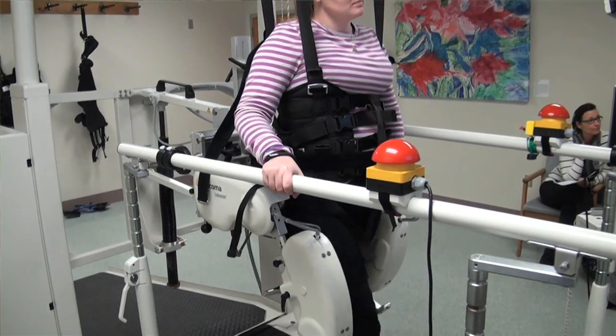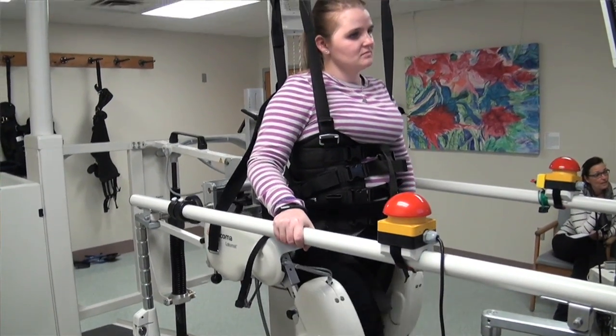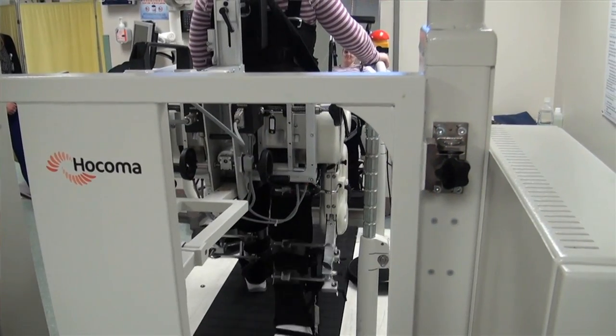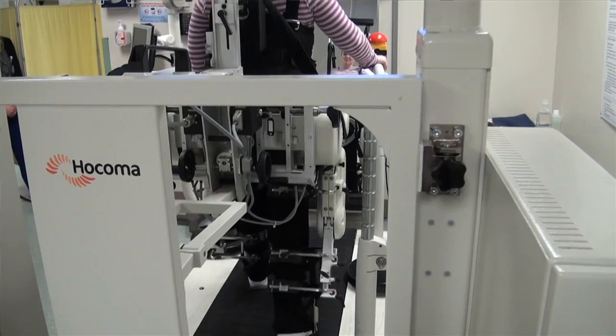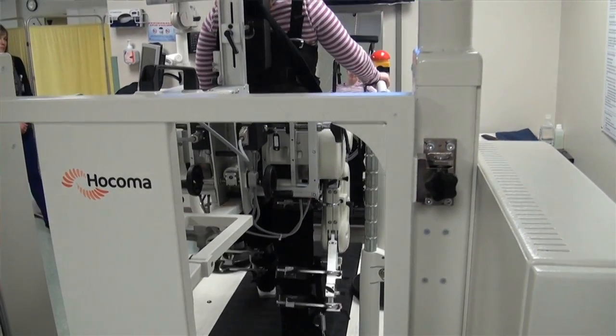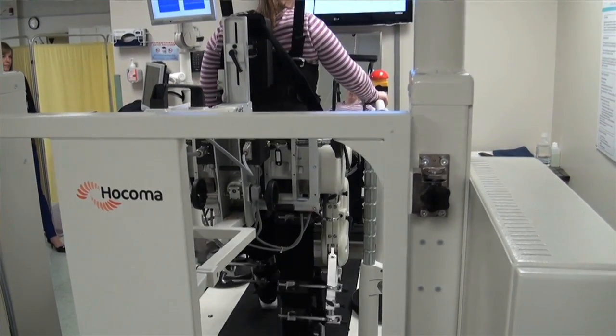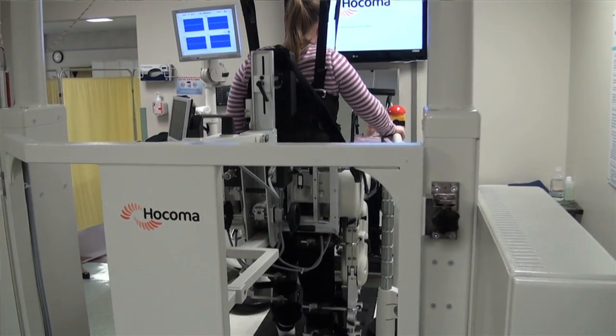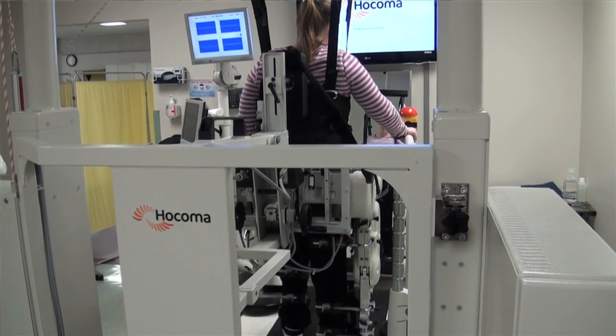It lets you repeat that same exact motor pattern, giving you guidance by bringing your leg forward so that you hit with your heel first — a critical part of walking. The harness holds you up enough so that as you take weight onto your legs, even if they're weak, your knees aren't buckling when your weight is on top of them.